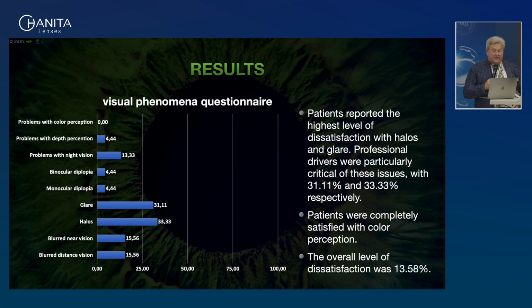The highest levels of dissatisfaction were reported for halo and glare, particularly among professional drivers, 31 and 33% respectively. The patients were completely satisfied with color perception. The overall level of dissatisfaction was 13.5%.